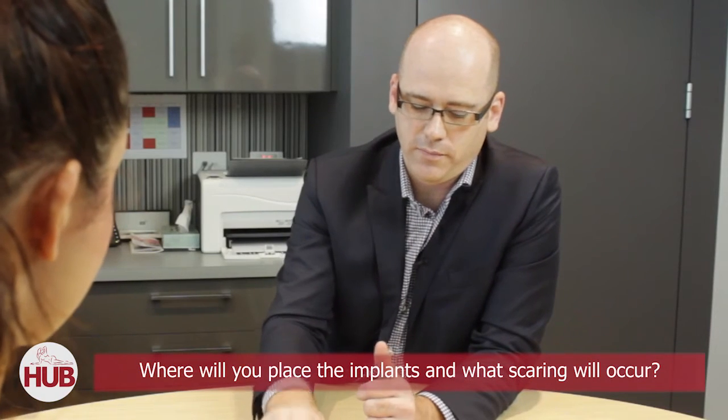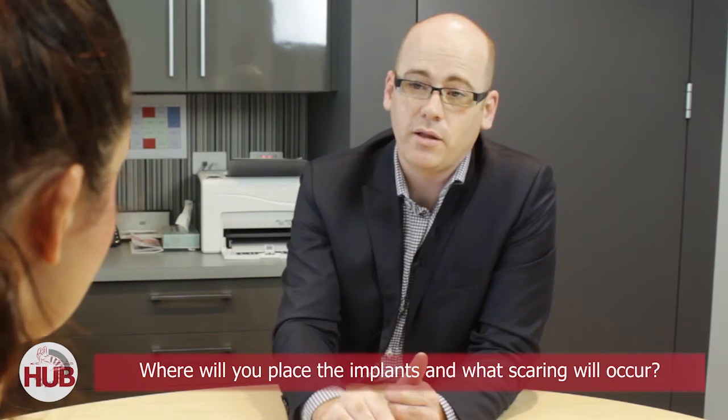So then we look at implants, where we put the implants. So we can put implants in on top of the muscle or below the muscle, or a combination of what we call dual plane. And we go through, and there's pros and cons why we choose one over the other.